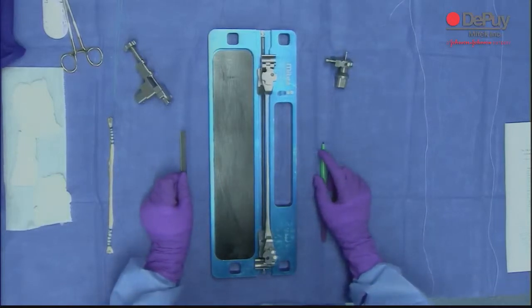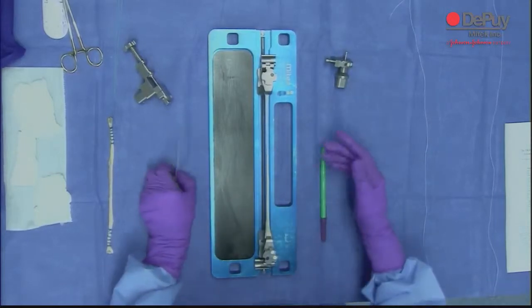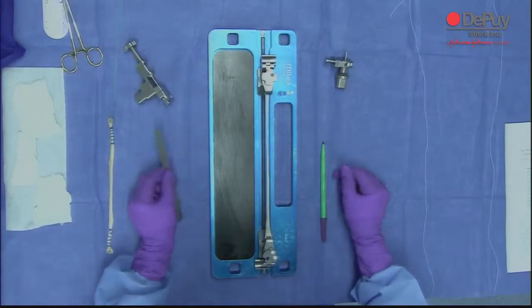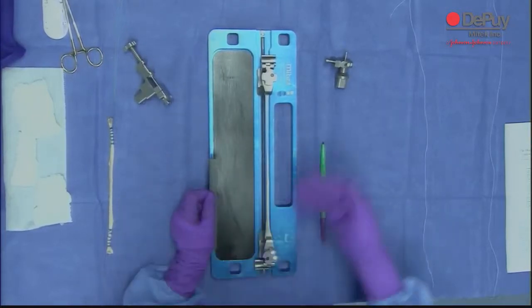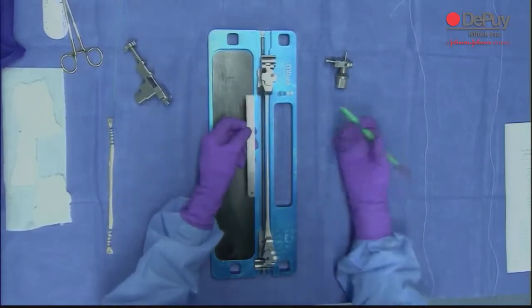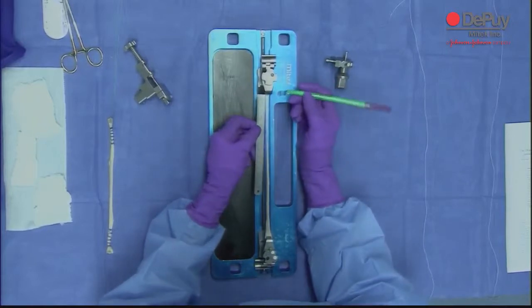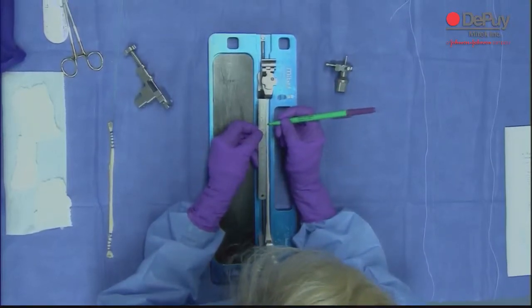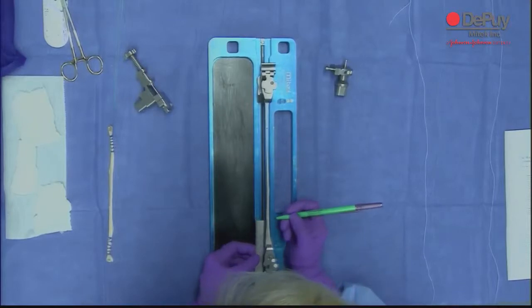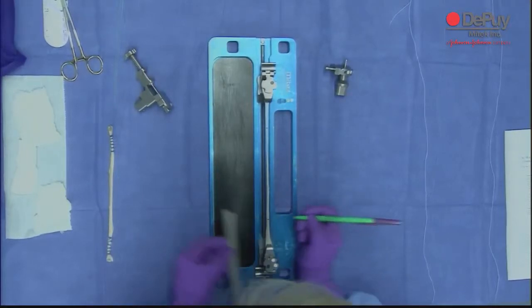I'm here today to show you the modified finger trap suture technique for preparation of the graft. I already prepared one over here. I'm going to show you how to do it here. First thing I do is put the graft on the board, and I'm going to mark 40 millimeters on each end so I have an idea of where to start.